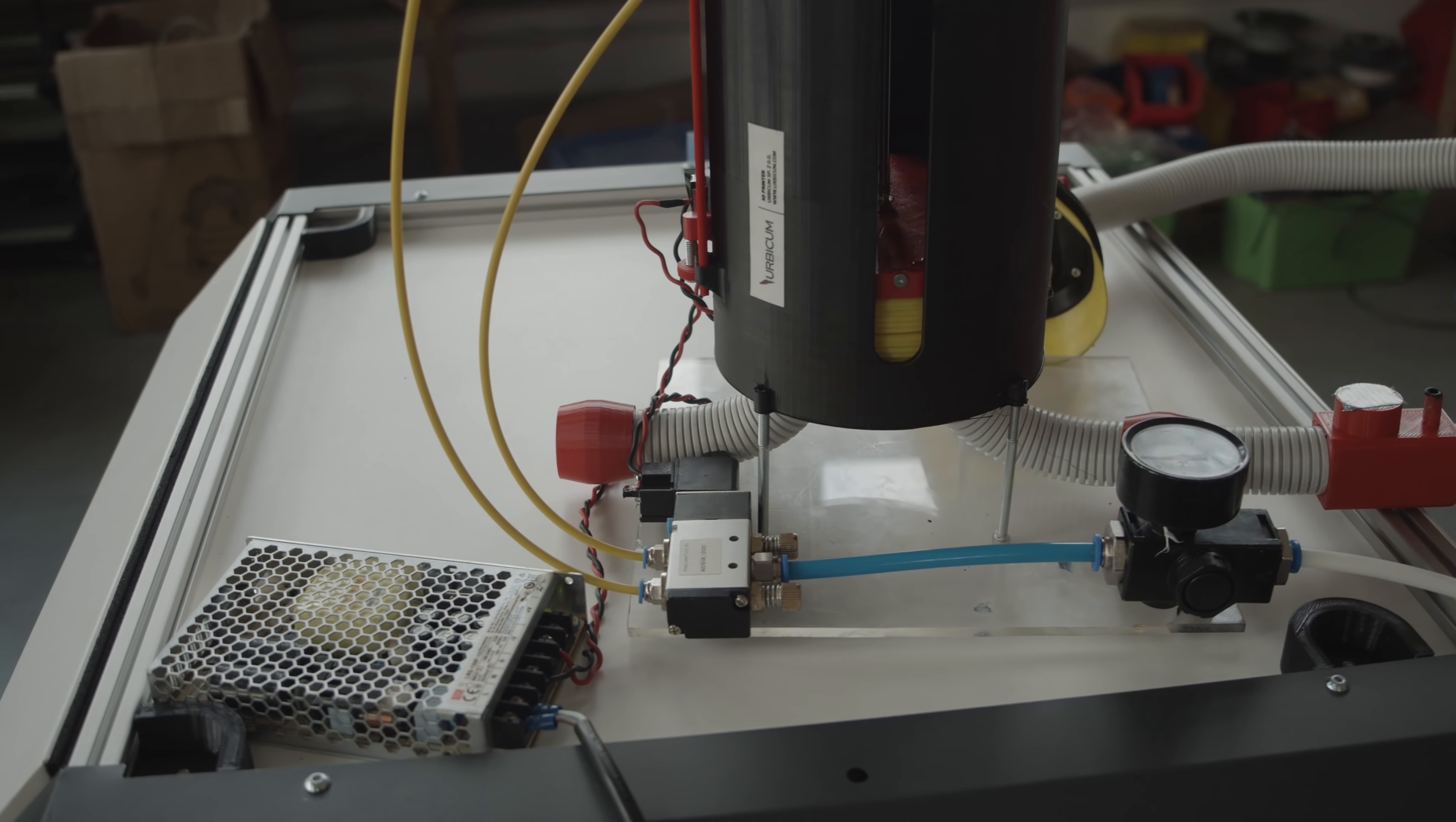We believe that the poorest countries in the world will face the problem of shortages of medical equipment, especially complicated medical equipment. Among them there are ventilators. They won't be able to buy it because there won't be ventilators.